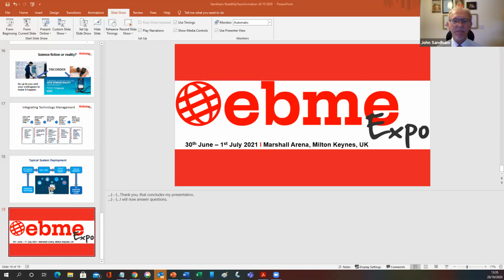Well, Carla, the important thing about this is making sure that your software partners have the right levels of security within their software. When you're choosing to move the data from the equipment to the EPR, there'll be interface software. There are a number of different interface software providers on the market, and it's about making sure that you and your procurement team choose the right software with the right level of security that will hopefully then avoid having cyber attacks that could possibly get to the EPR.